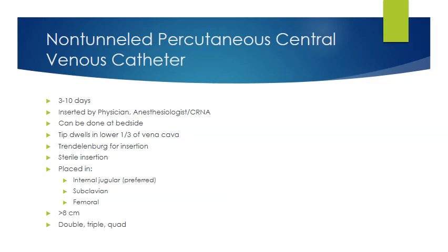In a trauma situation or a surgery situation, most of the time the patients who need these lines are a little bit dehydrated. So if we stand them on their head, so to speak, then gravity's going to take over, and that's going to push more blood up into that vein. So it's going to make it a little bit juicier, a little bit easier to get into. So that is a big reason that we put them in Trendelenburg.